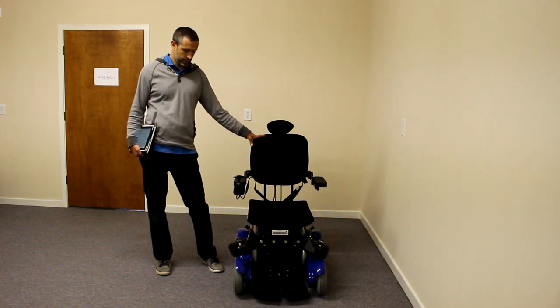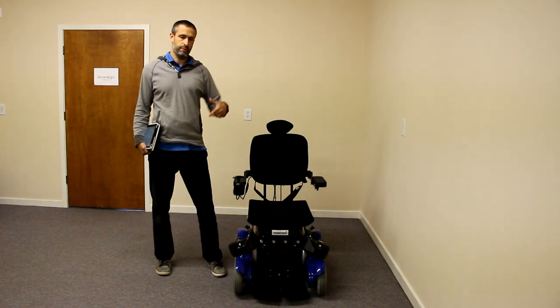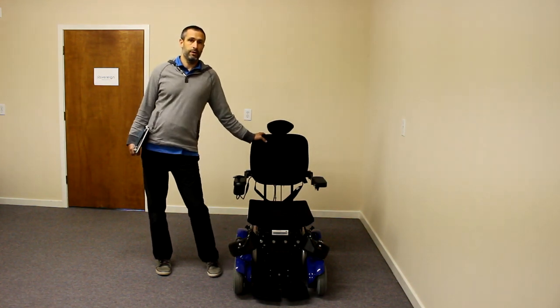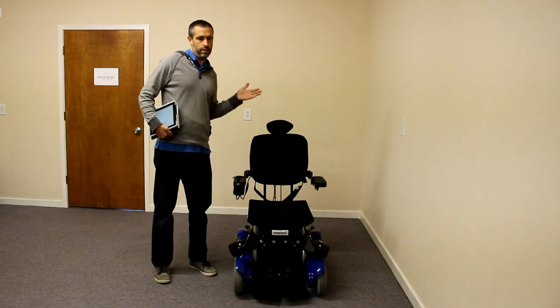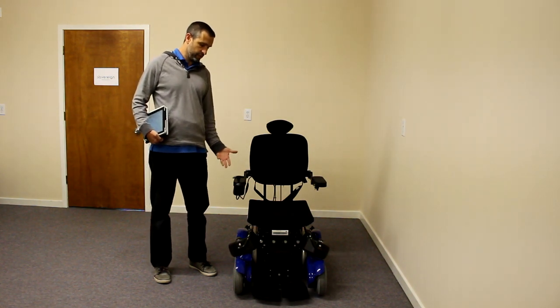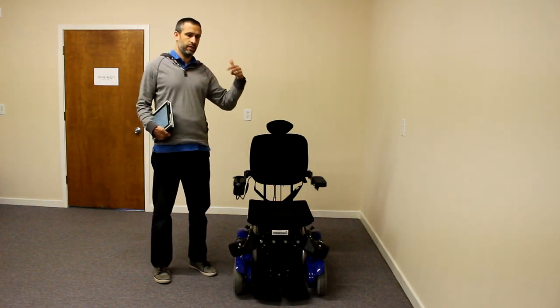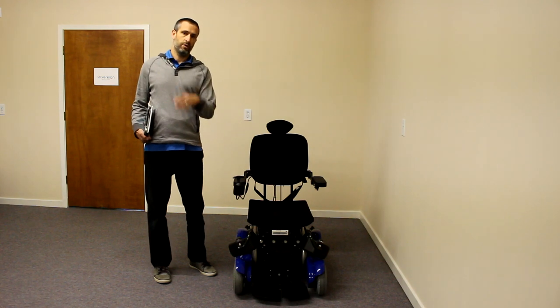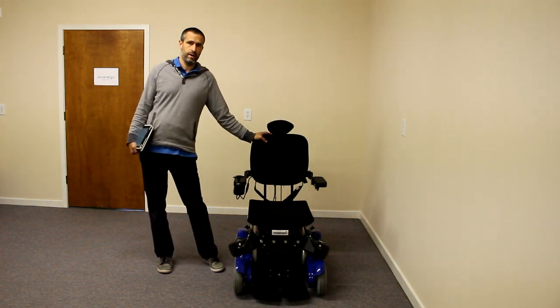The chair will not high center. The drive wheel will not be suspended in the air and stuck spinning when you hit an incline or a ramp. Anyone with a mid-wheel drive knows what I'm talking about — high centering. When the front wheels hit a ramp, the chair starts to go up and the mid-wheel lifts off the ground. On this chair, since the front wheels are powered, it will pull you right out. Probably the best chair I've ever seen for getting up and down ramps.